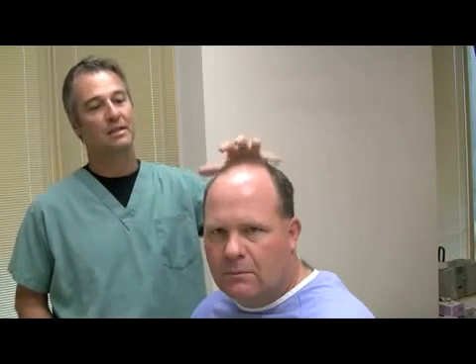So again, the place we're going to start is by removing a donor strip, and then I'll make some sites on the top. Now, I'm not going to actually show the removal of the donor strip, but we'll get busy with that. And the next part of this video will show us making some sites on the top here. So, Don, now we'll get you to lay on your tummy here on the first part of the procedure.